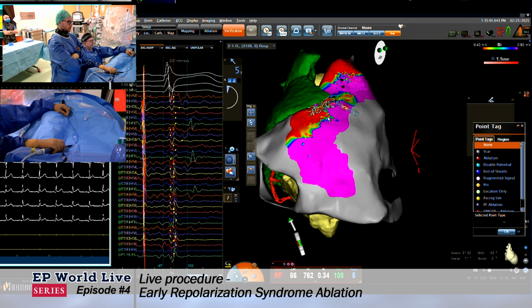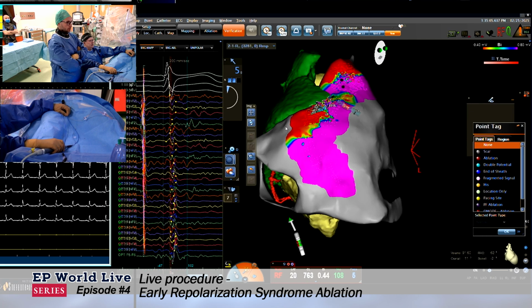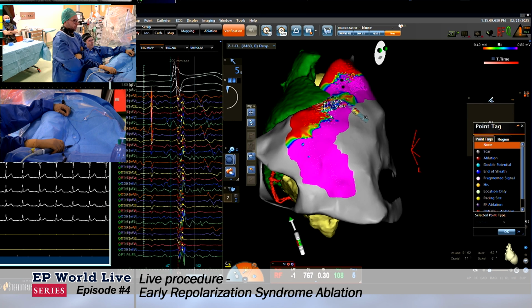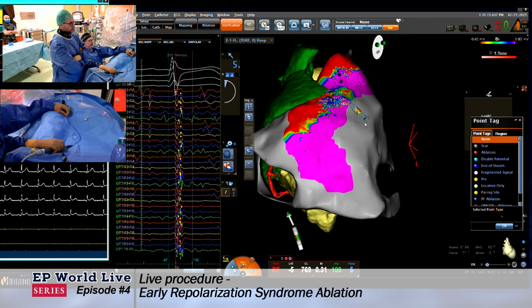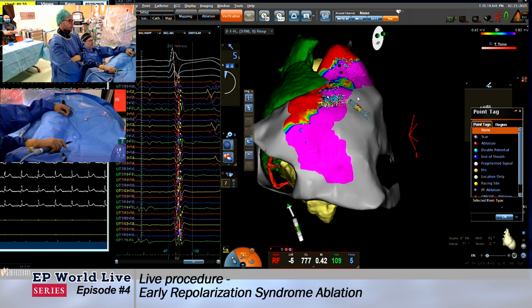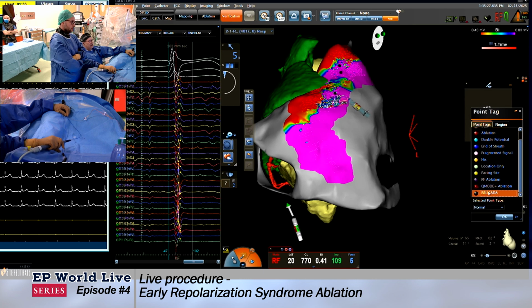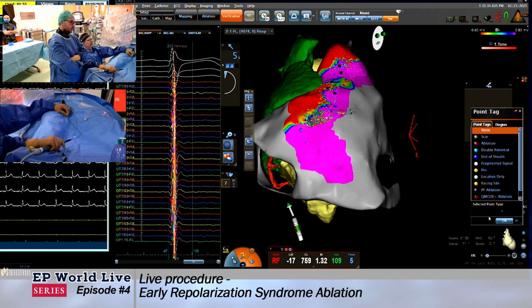You see? We have fragmentation here. What do you think, Giuseppe? But we are at the border of the right atrium, right. So I am pulling back the catheter, reducing the mapping of the right atrium. But at the border, you see, we have not a smooth and steady line. We have fragmented signals with lower voltage. Let me go in upstairs.